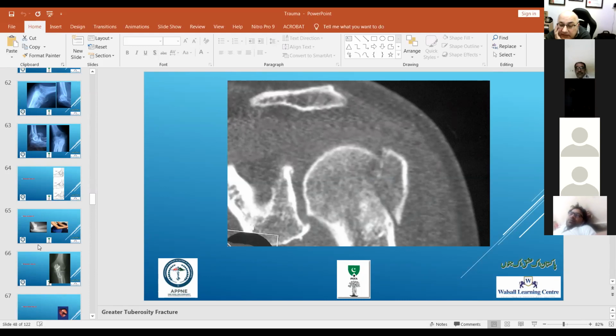Percutaneous screw fixation. So this is an osteopenic bone. You know, it's broken just from somebody falling. Do you think a screw is going to hold it? No, you have to buttress it with the plate.